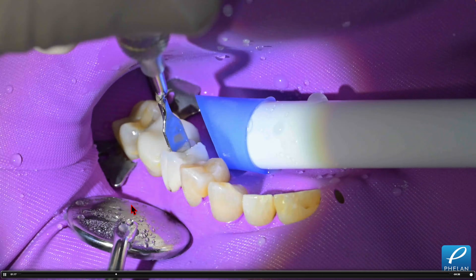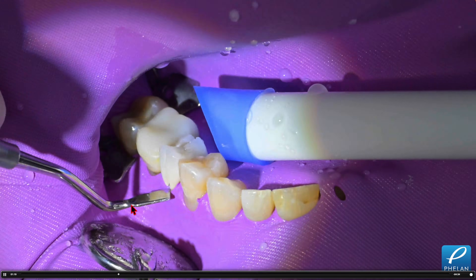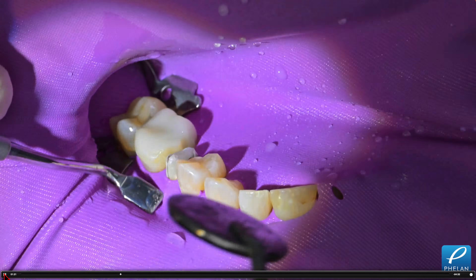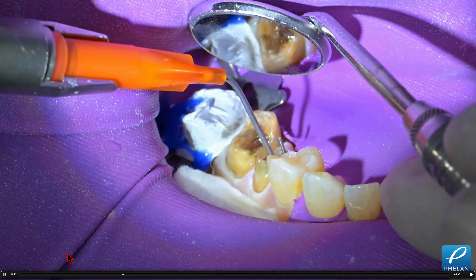And now I come in with the Brasler instrument. It's so easy on a lot of these cases — we're just spreading it with this instrument and it pops right out. It's very simple. Let me show you the core buildups here with this case.